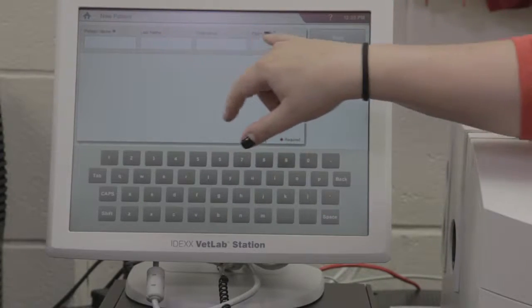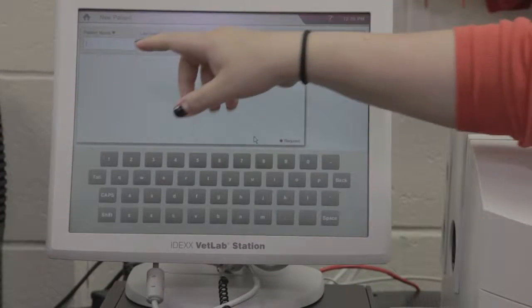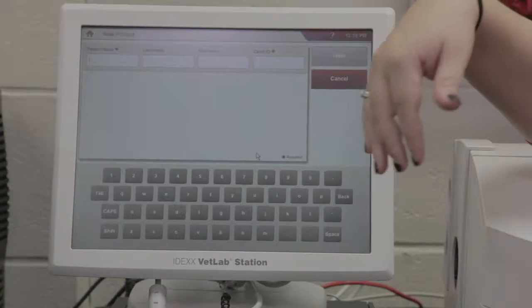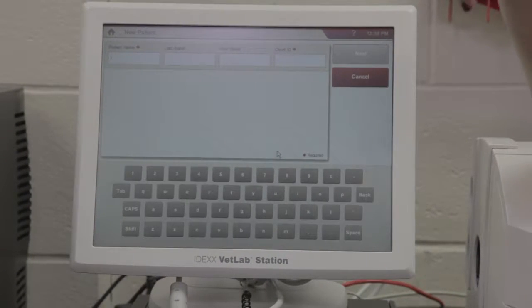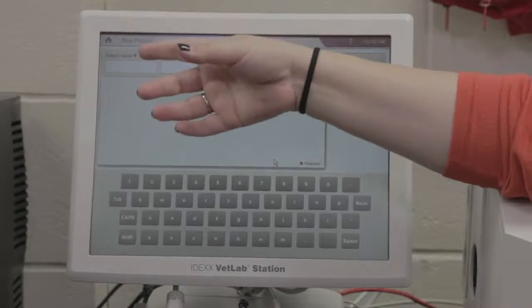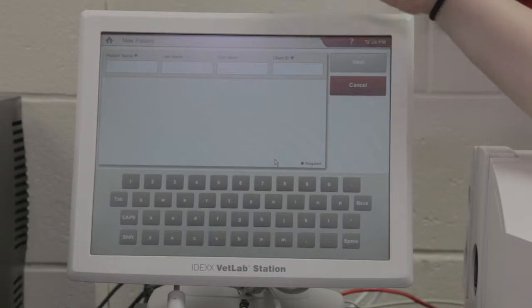Any information that is required has a red asterisk next to it, so you are going to enter that information there. In order for your information to transfer back into AVImark and into the patient record, your patient name has to be the ID number from AVImark. So instead of putting Fluffy Jones, you're going to put 12675 or whatever their ID number is, and then the client ID as well, and it will transfer back in.